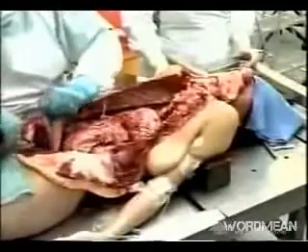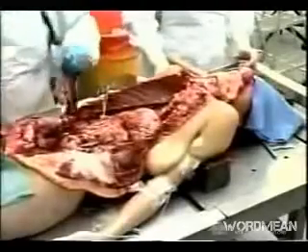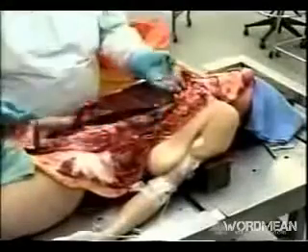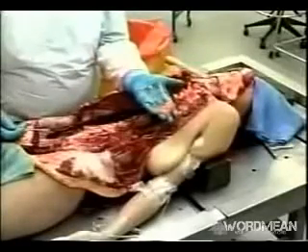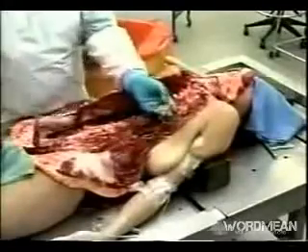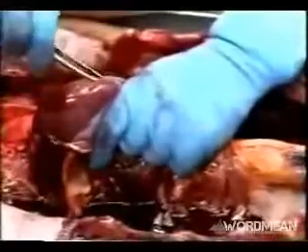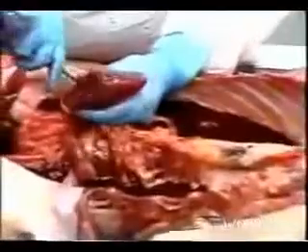And there we go. That's an adrenal gland, which he's dissected off the top of one of the kidneys. Is that the left? Dave? Right. Now he's incising the renal capsule, which is a thin membrane that surrounds the kidneys, and he'll strip that back to expose the kidney itself and then remove the kidney.